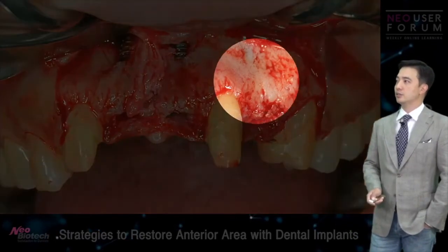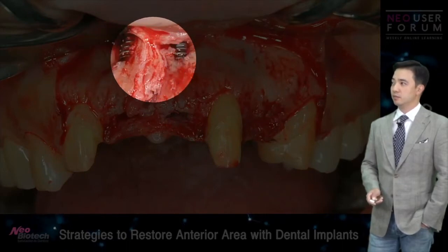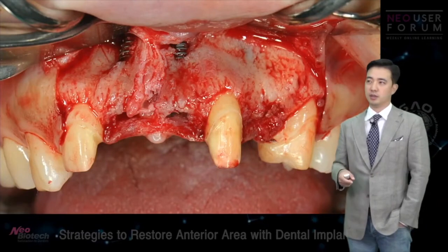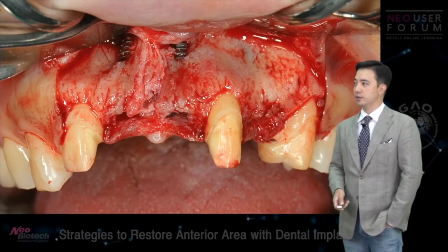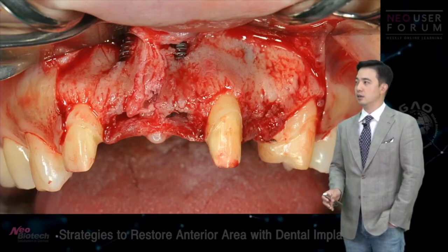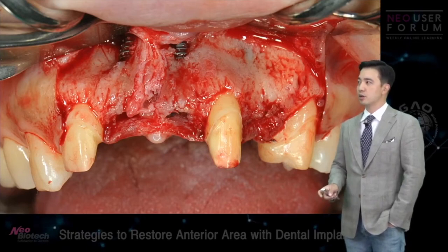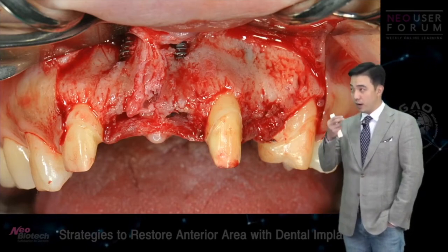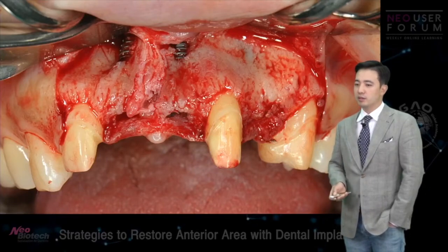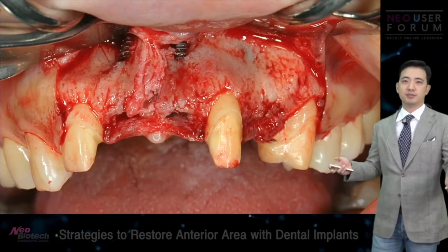As you look here, as we planned, the apex just came out of the alveolar bone, and I didn't really get surprised because I knew the implants were going to come out this way. The problem, however, was the amount of flap that I raised looked like this gigantic flap, right?